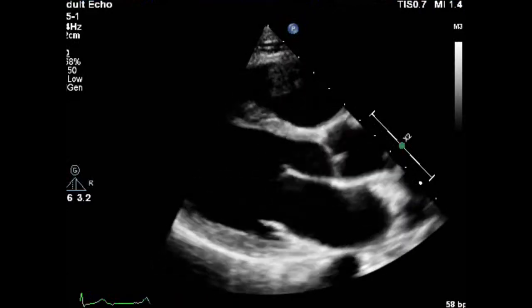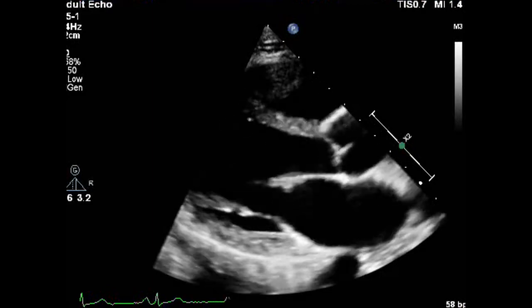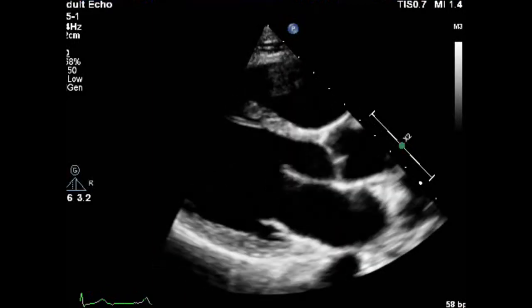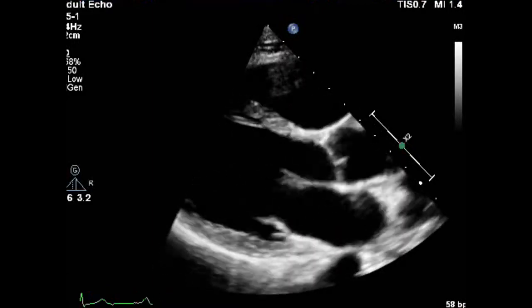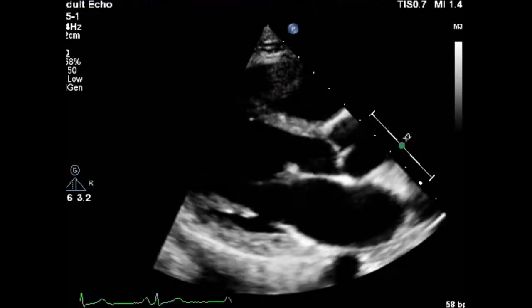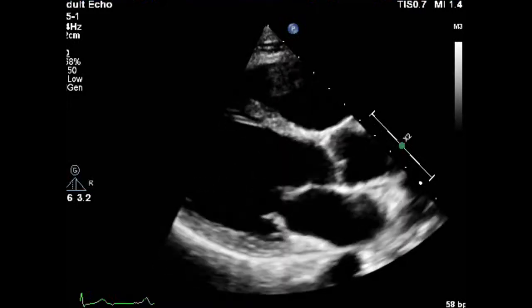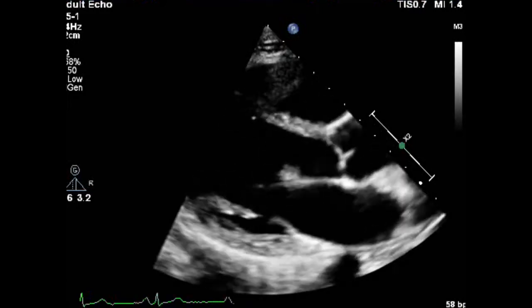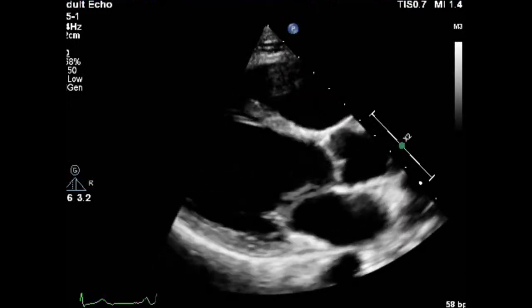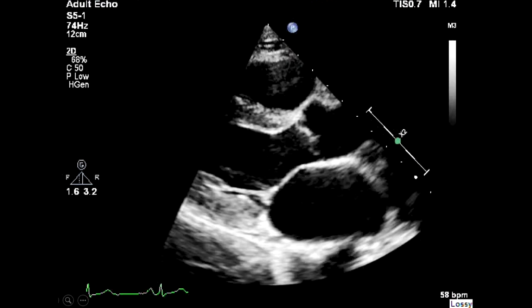The left atrium diameter is measured at end of systole. So the first thing you have to do is freeze the image in end of ventricular systole. We have here a frozen end of systole parasternal long axis view.